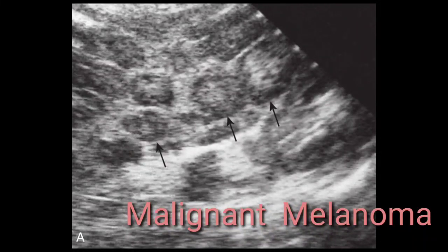These are actually metastatic deposits from melanoma because the patient had a history of melanoma already. So you have the previous report and investigations available with you. Take the measurement of the largest lesion. Mention on the report multiple target lesions of the spleen with possible differential of metastatic deposits. Clinical correlation and correlation with previous investigation and medical record is recommended.